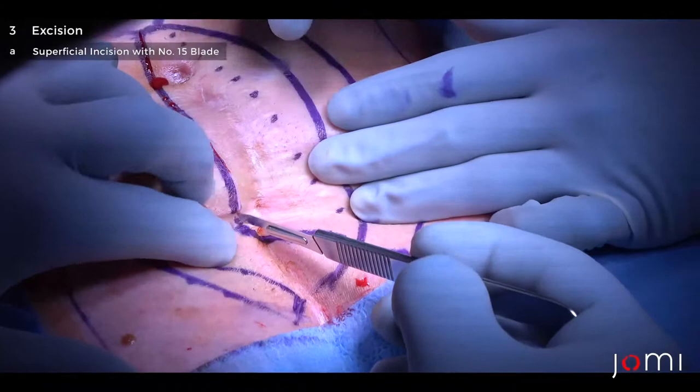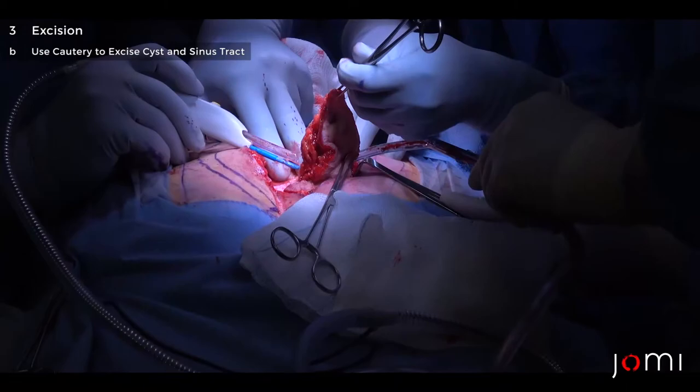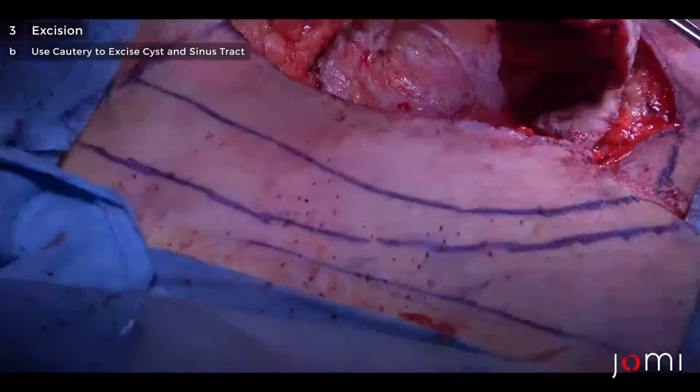The incision is always made with a 15 blade just for precision. We use a needle tip cautery for precision to get into the subcutaneous tissues, and then we excise the cyst, basically looking for the area of disease. We want to leave normal fat behind and remove the infected tissue, which is typically either purple or brown in color.